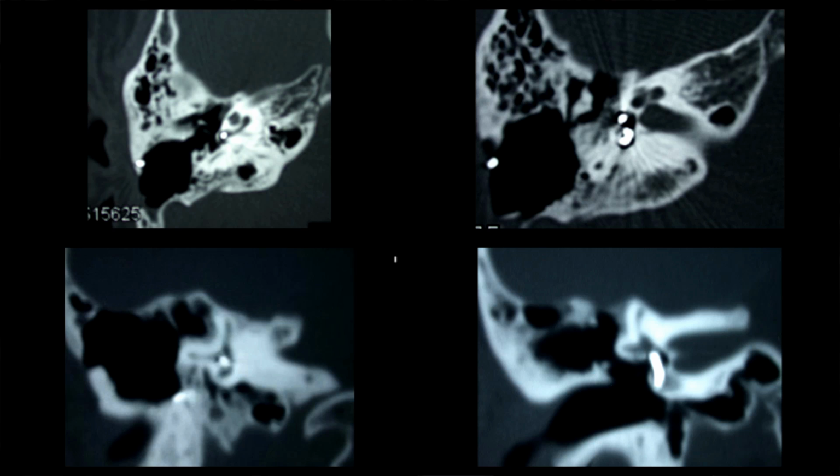Occasionally, an electrode will back out of the cochlea, sometimes long after the implant procedure. If changes in the recipient's map suggest that the electrode has moved, CT scanning can determine how much of the electrode remains within the cochlea. These four images show that the electrode array has coiled up in the vestibule and is not within the cochlea. The electrode in this image is extracochlear. It has passed below the cochlea into the hypotympanic air cells.